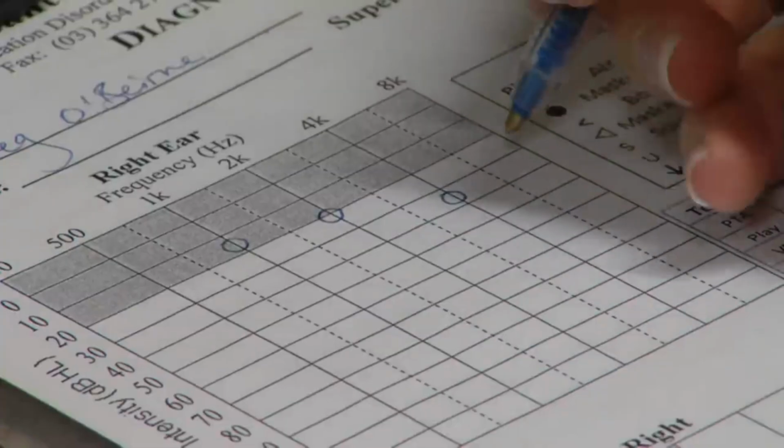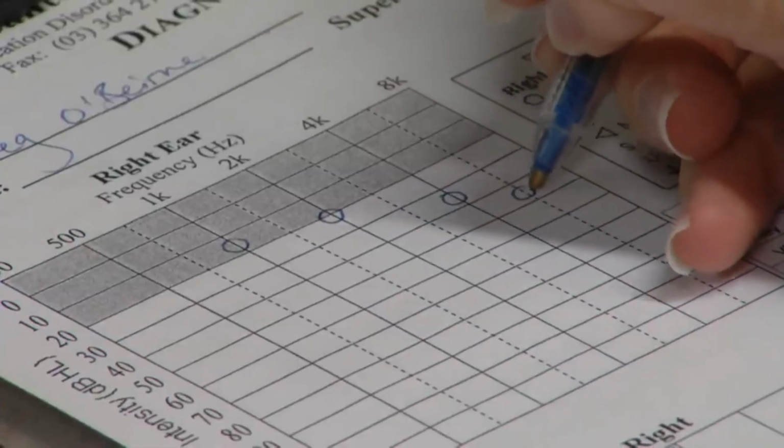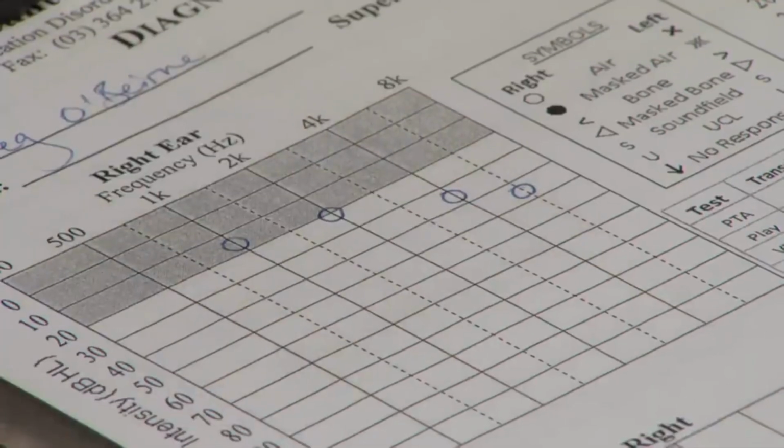Once testing is complete, the audiologist integrates the data across each of the different tests and presents the findings to the client. Right, that was great, Greg. So we're finished there. So just showing you the results. There's two graphs here for the right ear and the left ear, and they're graphs of your hearing levels.